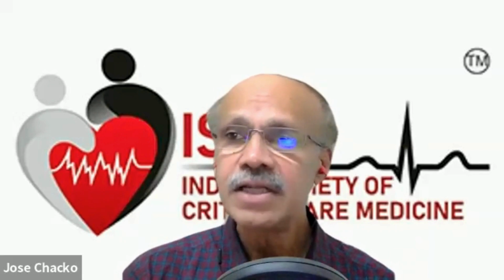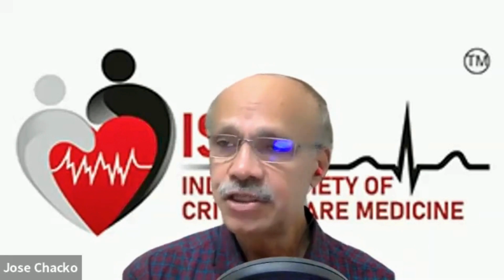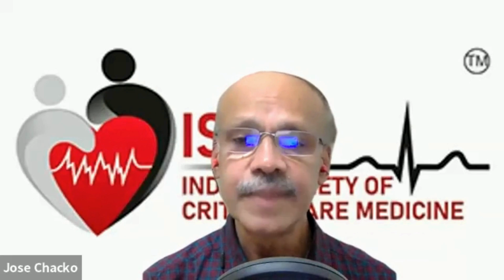So based on these findings, you can tell if the lungs are indeed recruitable and whether the application of PEEP will actually improve recruitment, open up more alveoli, and improve the oxygenation and the compliance in your patient. In fact, several preliminary studies have been done in this regard. We are also in the process of doing a trial in this.